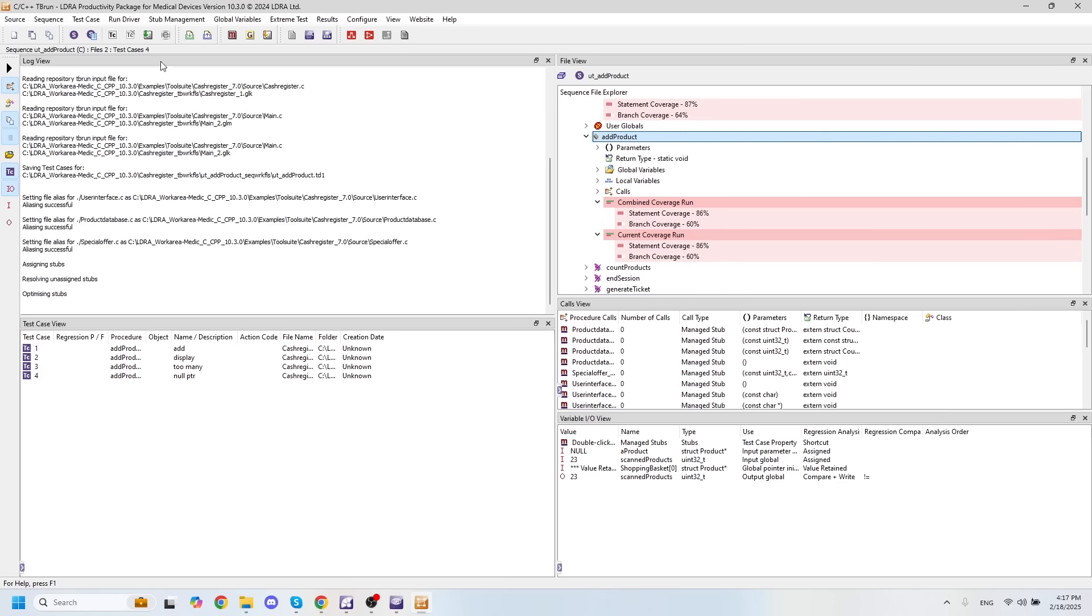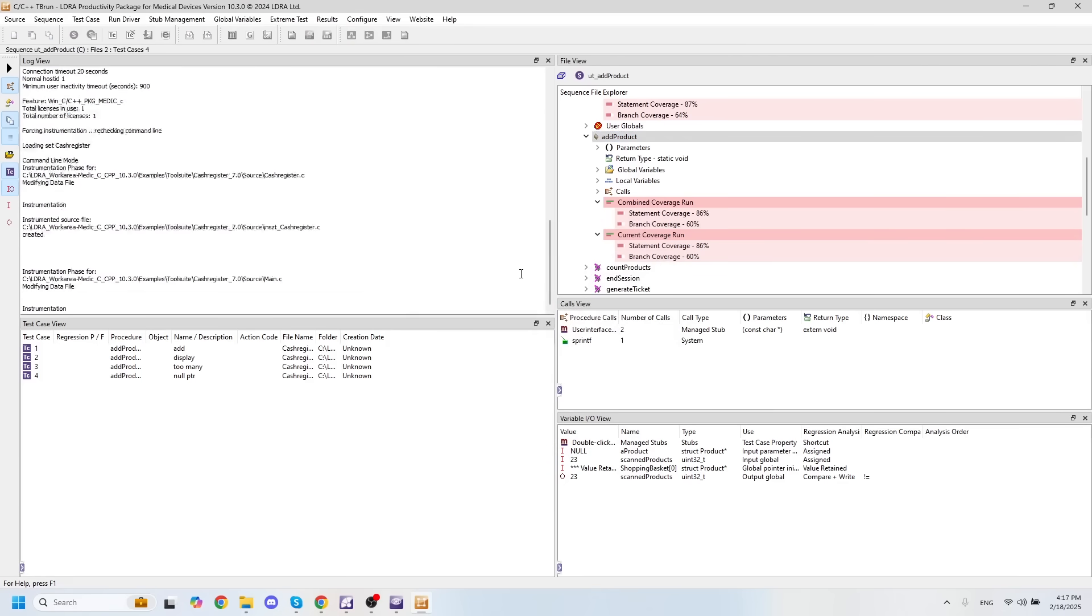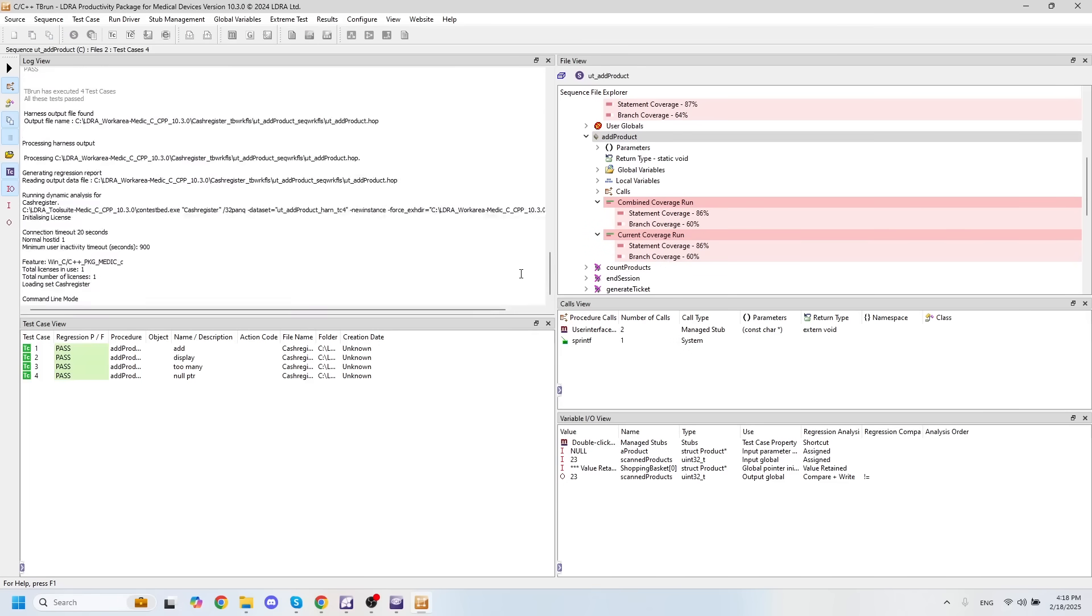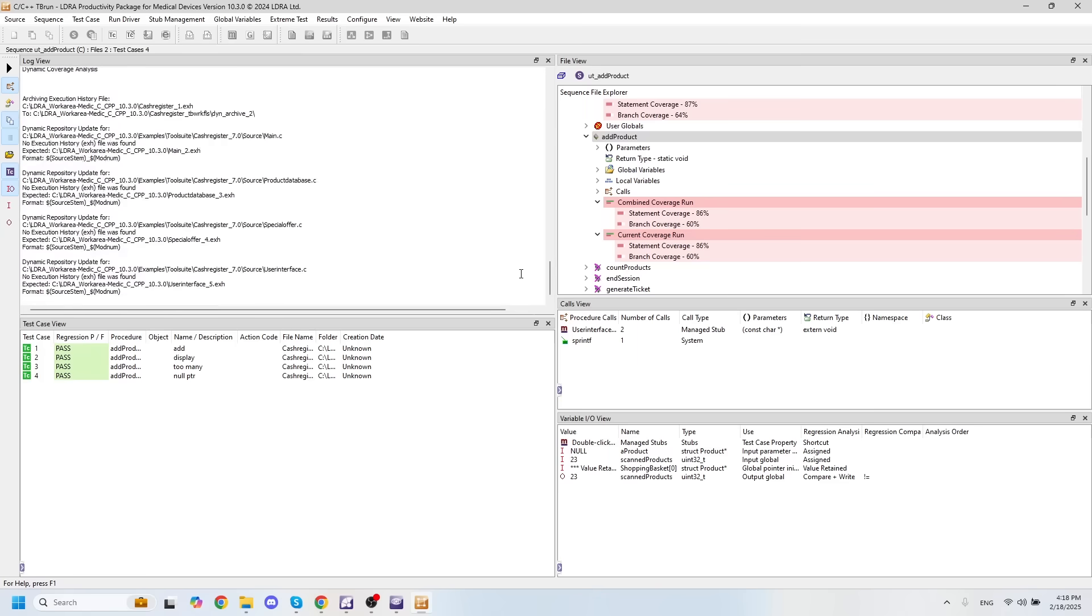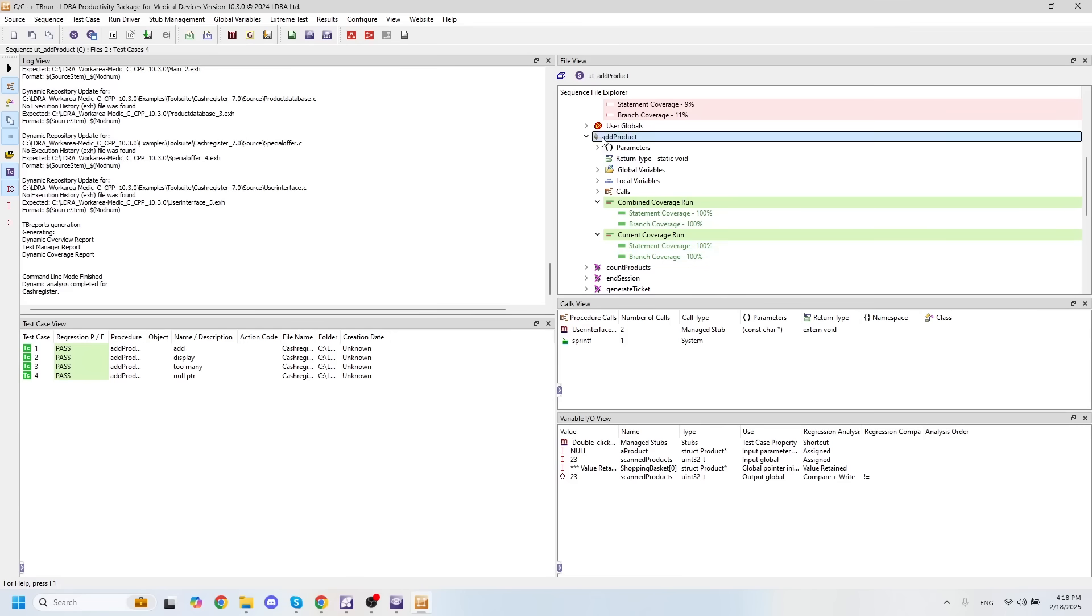And now that our test cases have completed, we can see that all four test cases have in fact passed, and we've increased our coverage up to 100% statement and 100% branch decision coverage for the add product function.